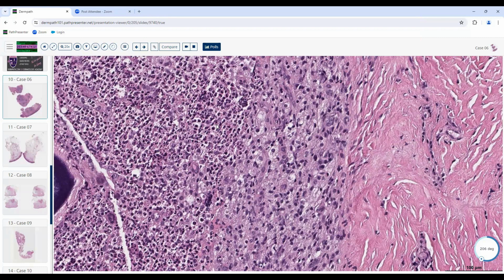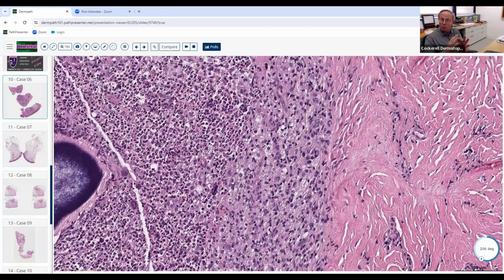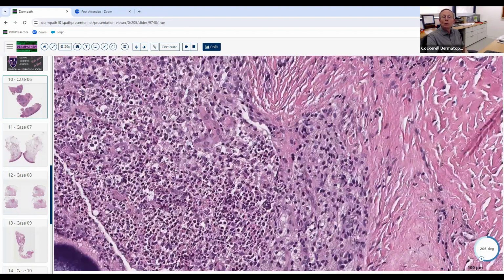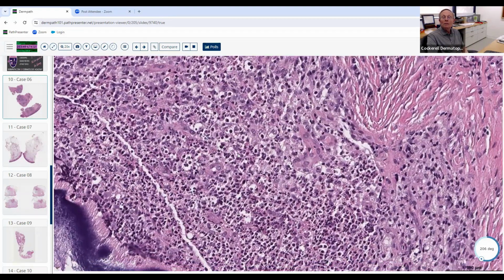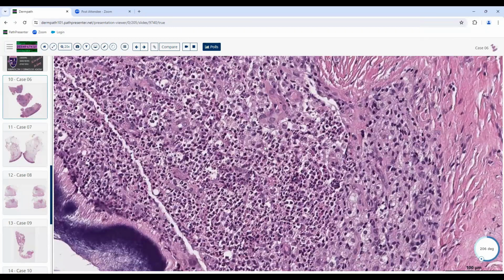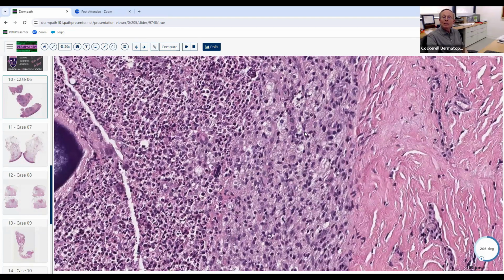Like foreign body? Well, foreign body is one pattern, but there you actually see a foreign structure in there with the inflammation. But when you have neutrophils plus histiocytes, when you have neutrophils only, what do you call that? Suppurative, right? Yeah, suppurative. Okay. So if you have suppurative with granulomatous, it's suppurative granulomatous.